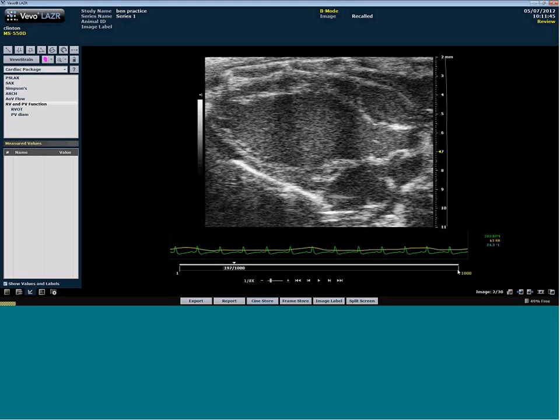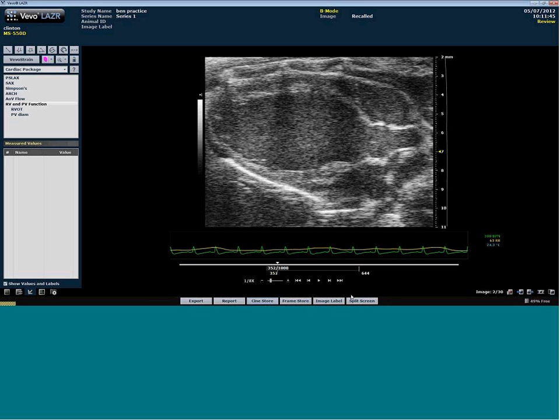or 1 here. You see a little hand pops up. You can click that and move it down to 300, which is a more reasonable size clip. Now when you go into VevoStrain, it will take these 300 frames and put those into VevoStrain. And you don't have to select those 300 frames, obviously. You can select frames from any section.